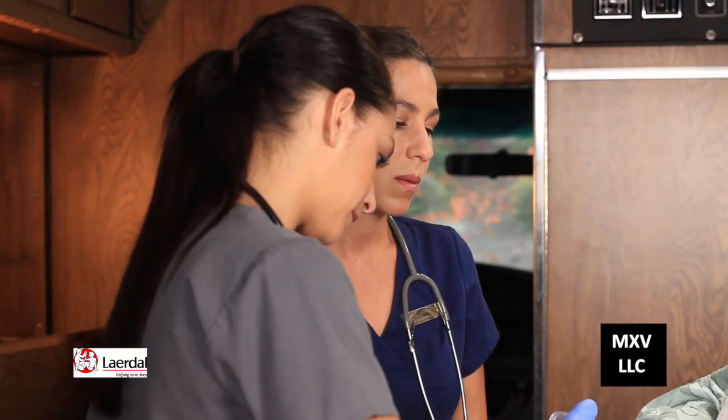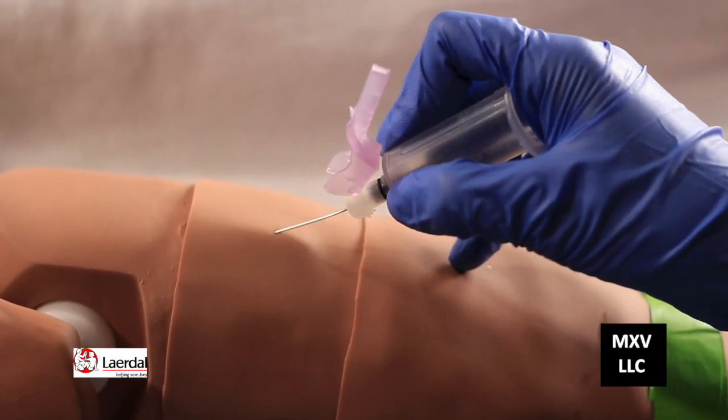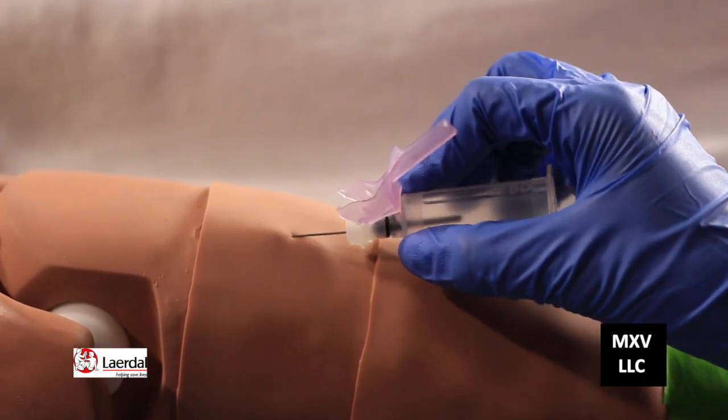Go ahead and set that down so you can use both your hands while you're drawing the blood. Tell the patient before you stick them that you're about to stick them. Mr. Marlboro, you're just going to feel a little stick. And as soon as you get in there, bring the needle down.